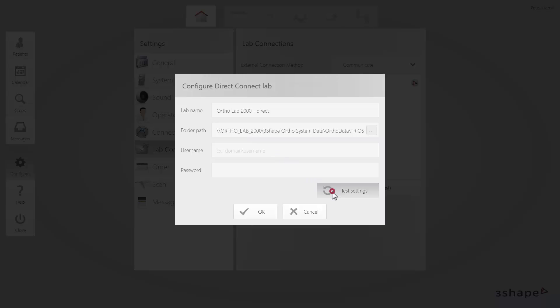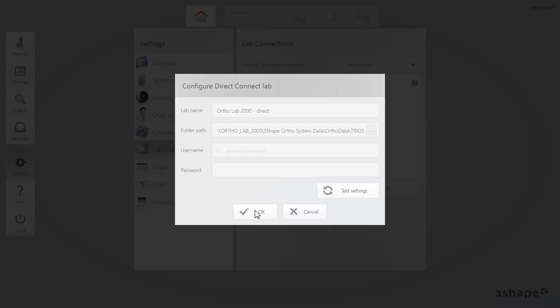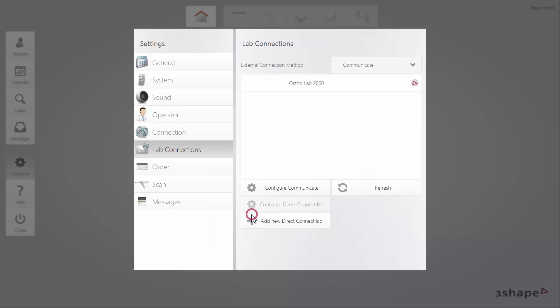Remember that you can click the Test Settings button to check the connection. When ready, click OK.